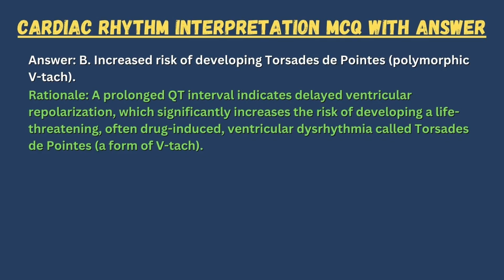Rationale. A prolonged QT interval indicates delayed ventricular repolarization, which significantly increases the risk of developing a life-threatening, often drug-induced, ventricular dysrhythmia called torsades de pointes, a form of V-Tach.